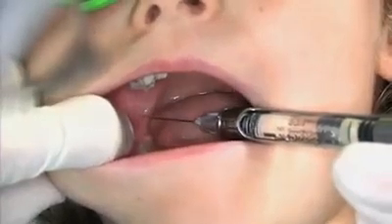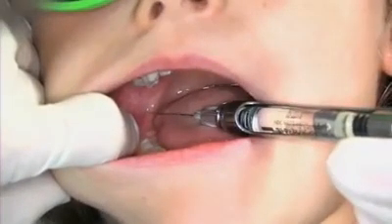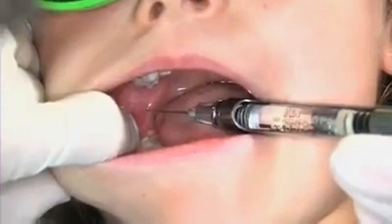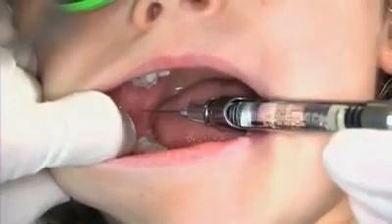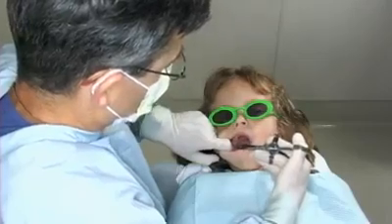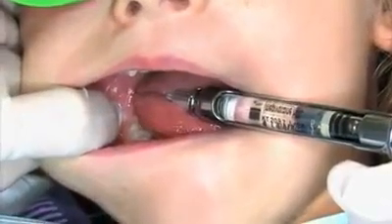The needle penetrates the tissue and a few drops of local anesthetic are deposited. The needle is then advanced until the ramus is contacted just posterior to the internal oblique line. The needle is then advanced toward the lingula, stopping after five millimeters to deposit 0.5 cc's of local anesthetic to anesthetize the lingual nerve.